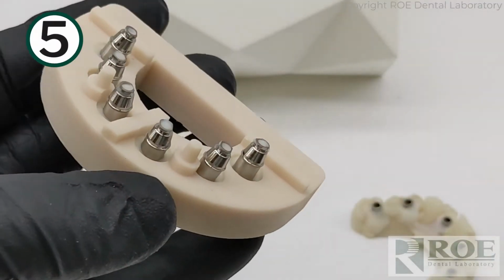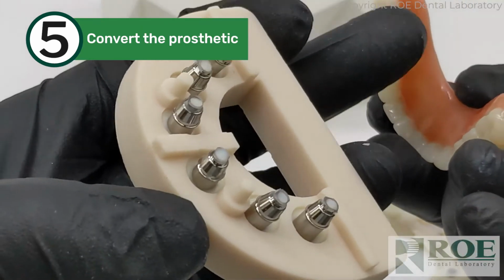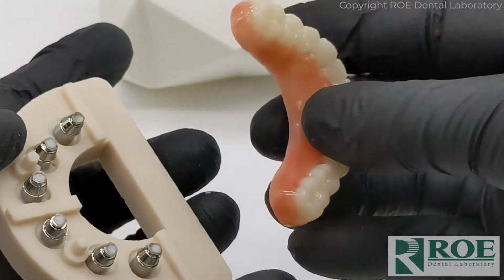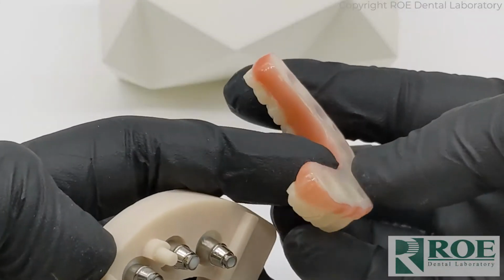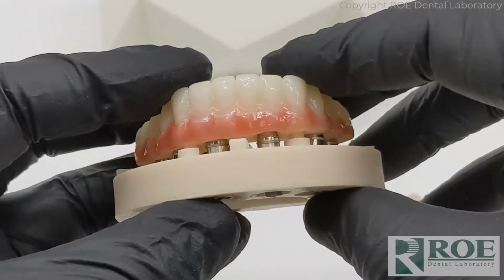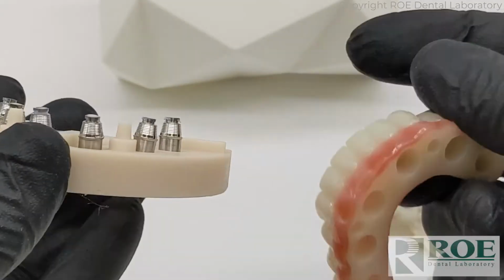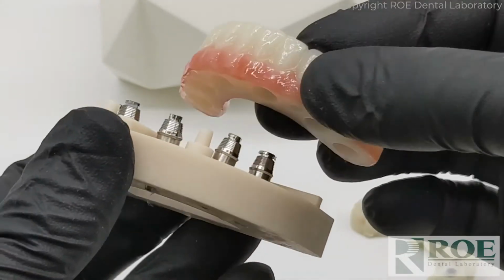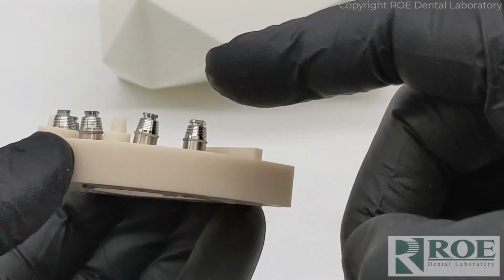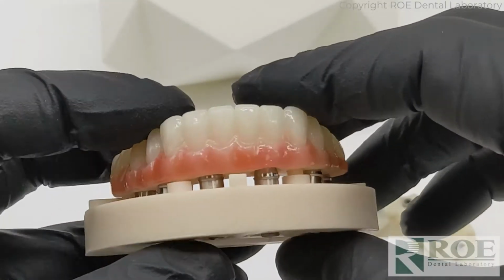So the next step is pretty simple, really. This prosthetic needs some lingual ports, and it will come with lingual ports. I made this one as a demonstration, so I'm going to go drill out some lingual ports. But while I'm doing that, what you'll see is that the holes on the prosthetic should fit intimately with the copings. But if an implant was placed just a little bit off, a little deviation, like you can see, this implant just looks like it's a little bit off. See that? Then you'll see that it's not passively fitting into the prosthetic.